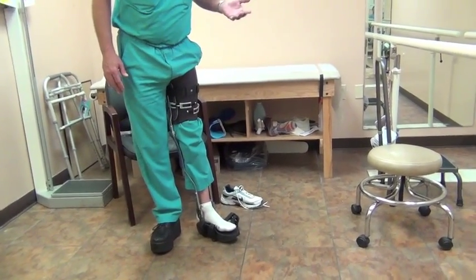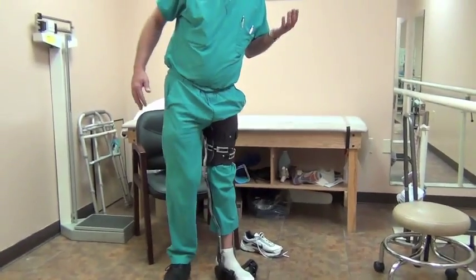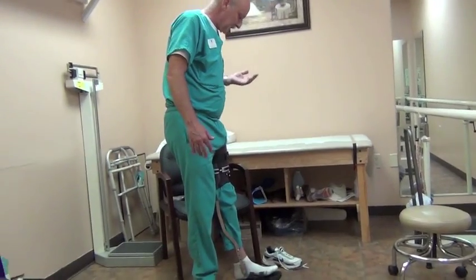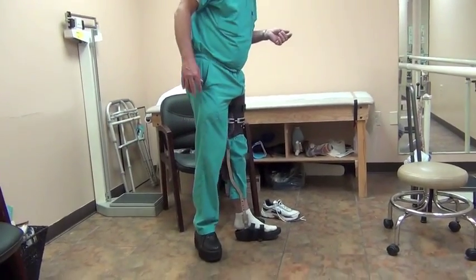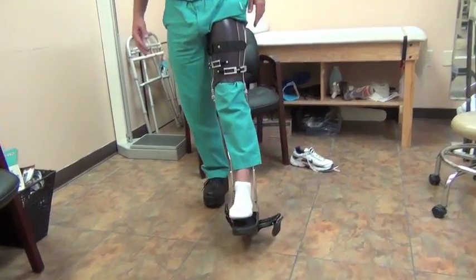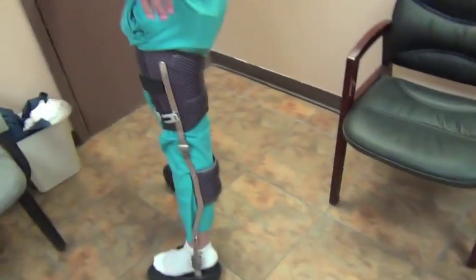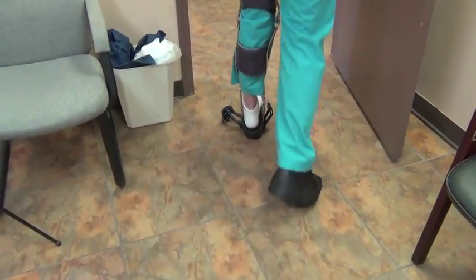It wouldn't look real pretty, but this isn't designed for beauty. It's designed for function and it does function. I'm going to go out in the hallway so you can watch me walk in a little bit larger area and get an idea of how it works in gait.